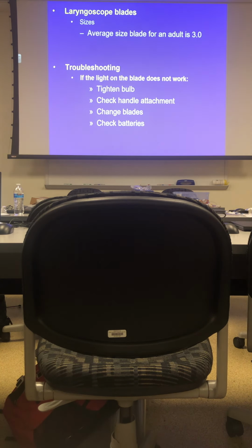What position do you think we're going to put the patient in when we're intubating? What's that position called we always talk about? Slightly hyperextending the head. Begins with an S. Sniffing. So remember that. You need to know that. It's called the sniffing position you're going to place your patient in when you're intubating. And what does that do? When you slightly hyperextend, you're opening that airway so that it's easier to see the cords. All right, that's some troubleshooting, which I already talked about.